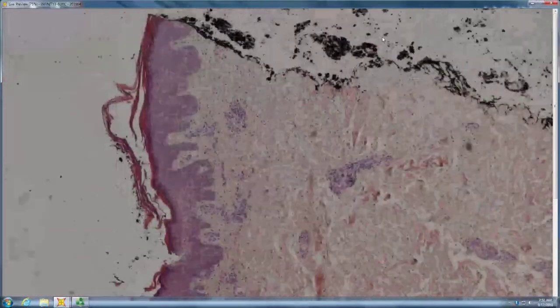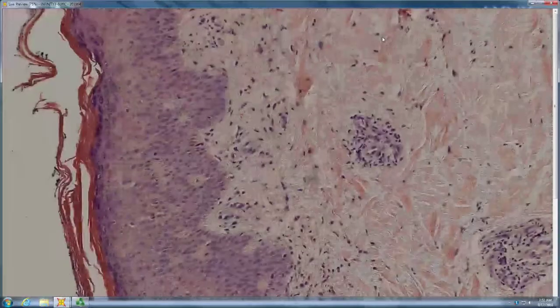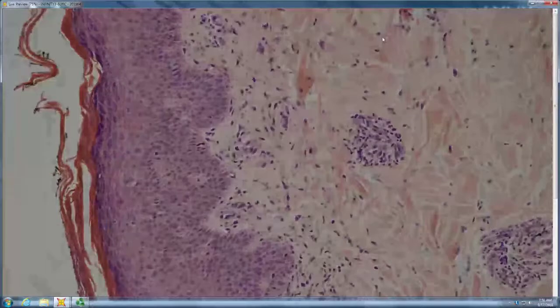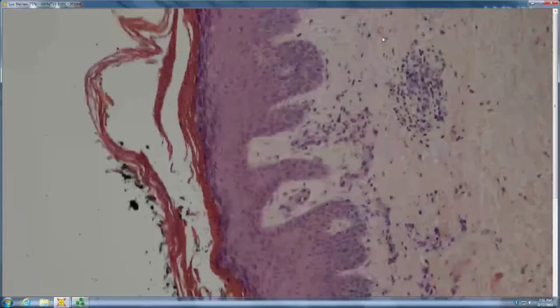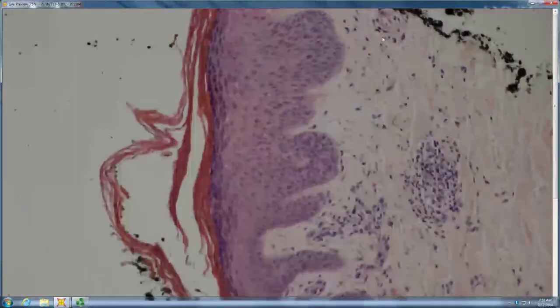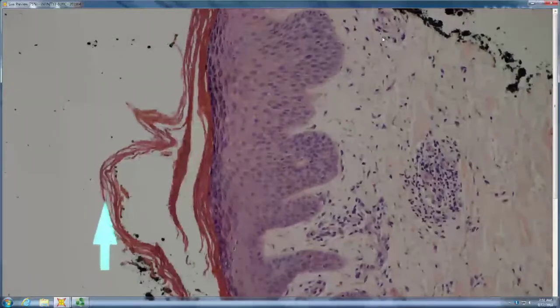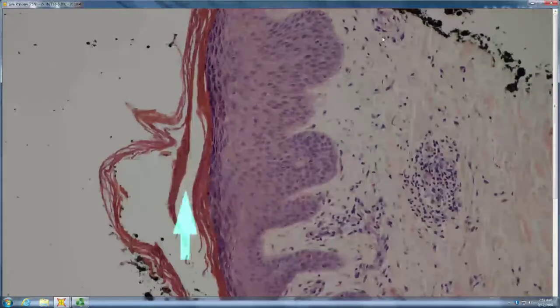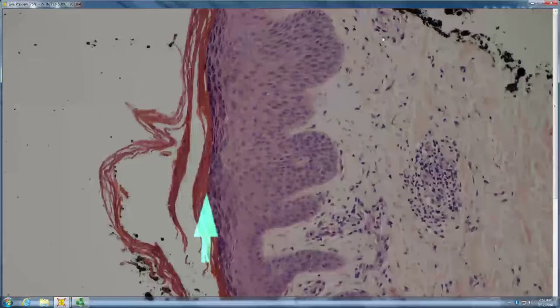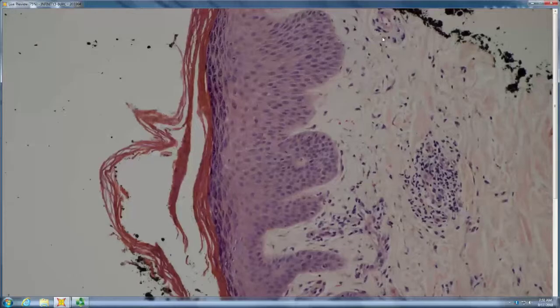So there's a punch, there's lots of perivascular inflammation, some acanthosis, epidermis. Horn is somewhat compact. How about up there? Basket weave over here. So basket weave there. How about there? It's compact there. So you're telling me it's basket weave over compact? Yes. So that's maybe tinea. That's what it is.